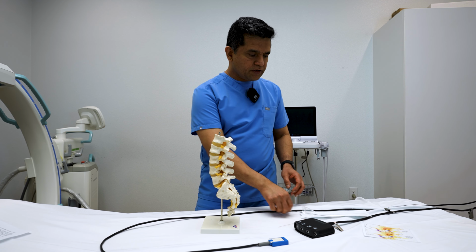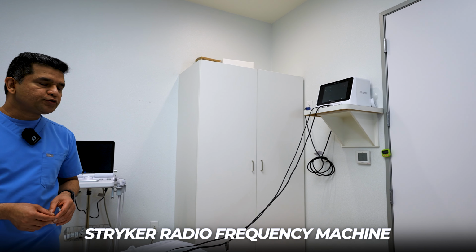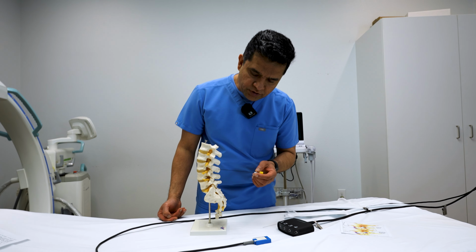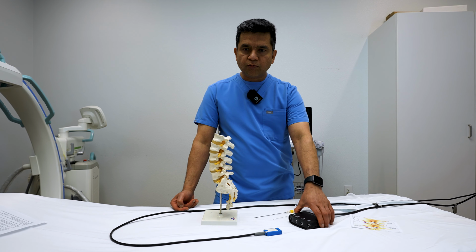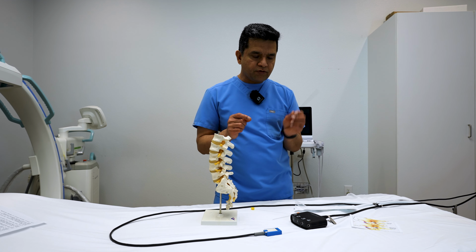And we do that with this radiofrequency needle, and we use the Stryker radiofrequency machine. That's a Next Gen 2. That's the latest machine. We use the X-ray machine again to guide the needle to accurate positioning, targeting the medial branches. We test the positioning with more electrode cables, and the electrodes are placed through the cannula itself. There's no skin cut, it's only needle puncture.